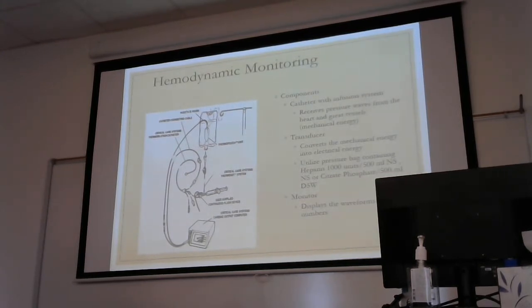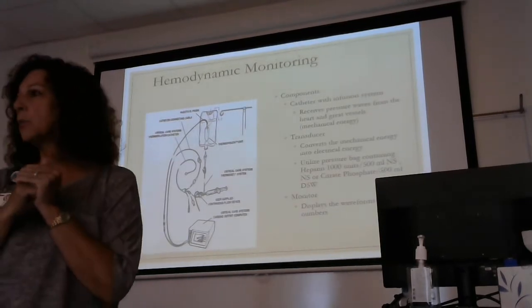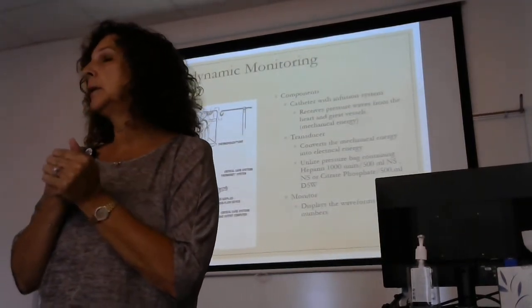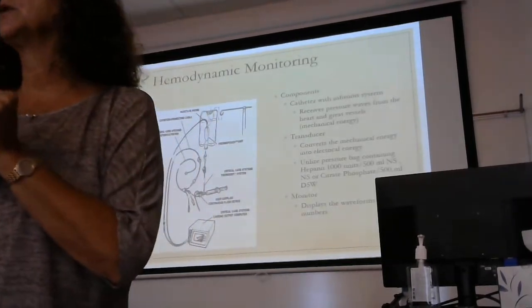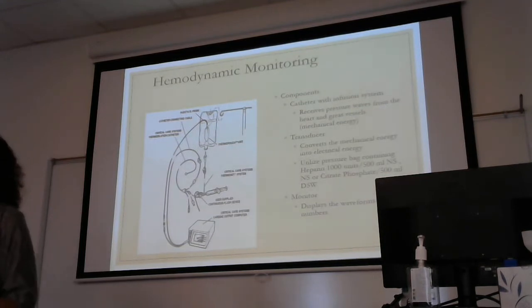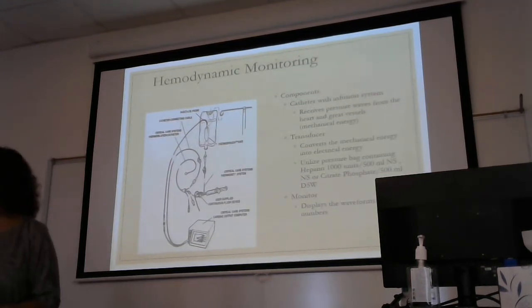No, ma'am. Head to the nose. Okay? We want it calibrated so that I know the weight I've got on there is legitimate. Ergo, that 300 millimeters of mercury needs to be consistent and maintained so that the number I'm seeing on my screen is indeed accurate, because that little bitty transducer is taking that energy and converting it to a number for me.